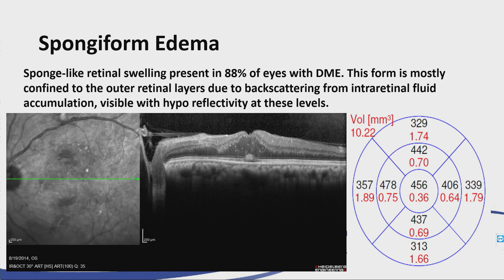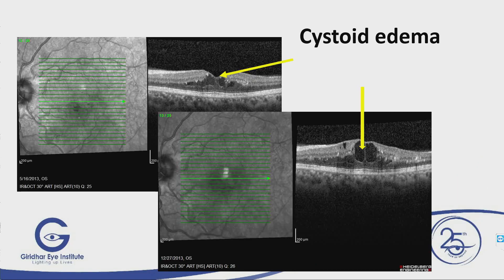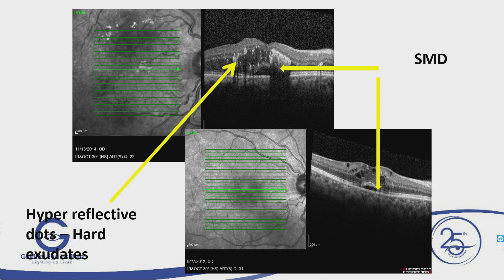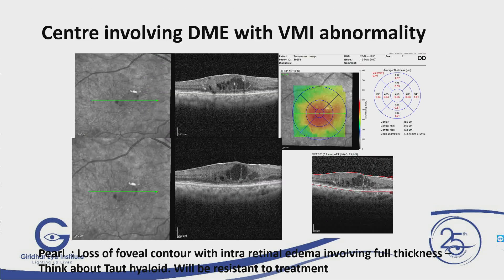This is cystoid edema — the arrow mark shows cystoid edema. This is serous macular detachment, and serous subfoveal detachment cases respond well to anti-VEGF injection with better visual outcomes. An important finding I have seen in many cases on treatment is a taut posterior hyaloid or an ERM-like picture — that will not respond to injections regardless of how many you give. That has to be specifically looked for.